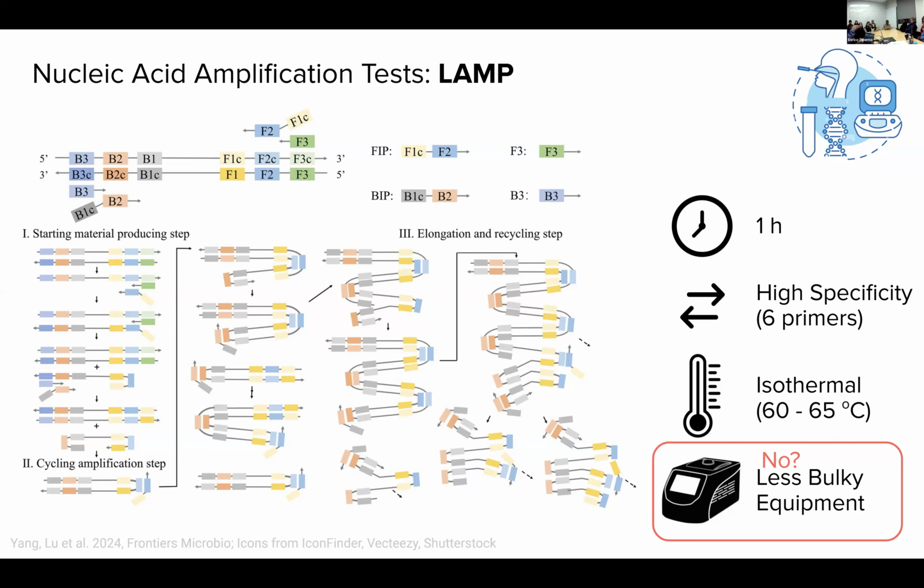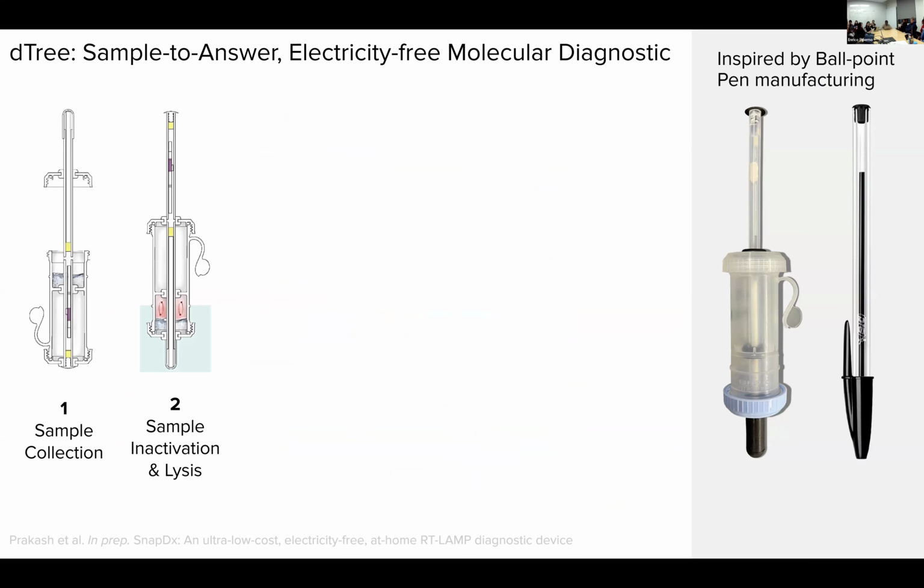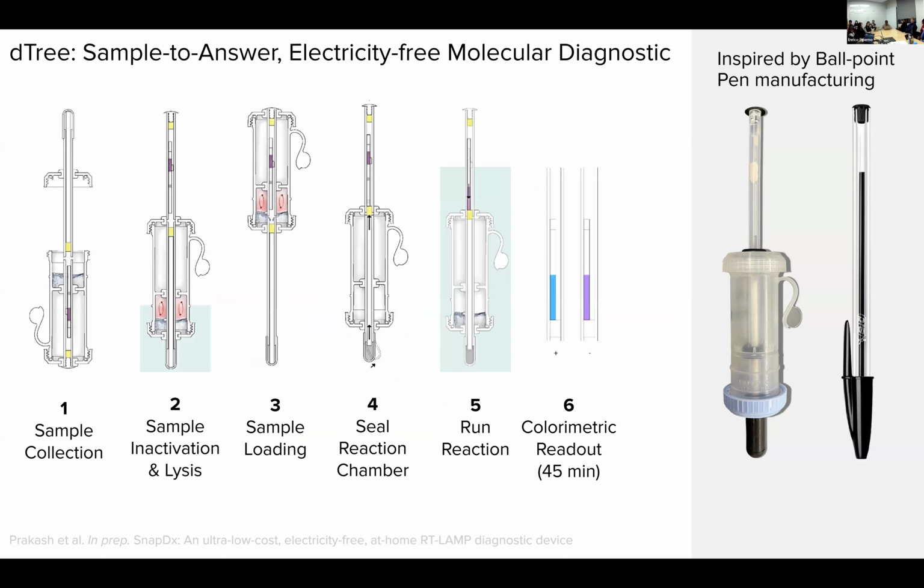So you kind of predicted the direction I was going in. LAMP typically requires less bulky equipment, but are we able to have no bulky equipment? Are we able to get rid completely of that equipment requirement? The answer is yes. And so I'm just going to flip very quickly through these.